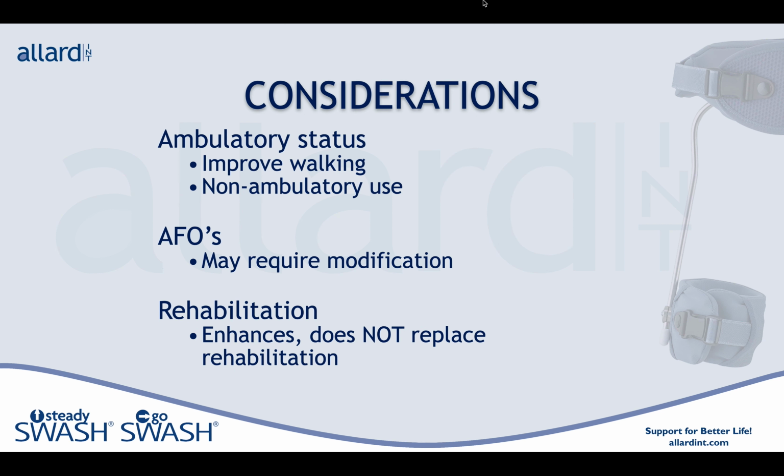SWASH orthosis definitely helps to improve ambulation as it helps to control scissor gait. There is lots of non-ambulatory use for the SWASH orthosis as well. In my opinion, the stable tripod base of support that the SWASH creates during sitting is one of the biggest benefits of the orthosis. That's because it allows the individual to use their hands to participate in their ADLs and to not have to worry about using their hands to control their balance so they don't fall over. Since we're changing posture, stance, and gait with the SWASH orthosis, if the individual is wearing any ankle-foot orthosis, those AFOs might have to be reevaluated because of all the changes we made to posture, stance, and gait.